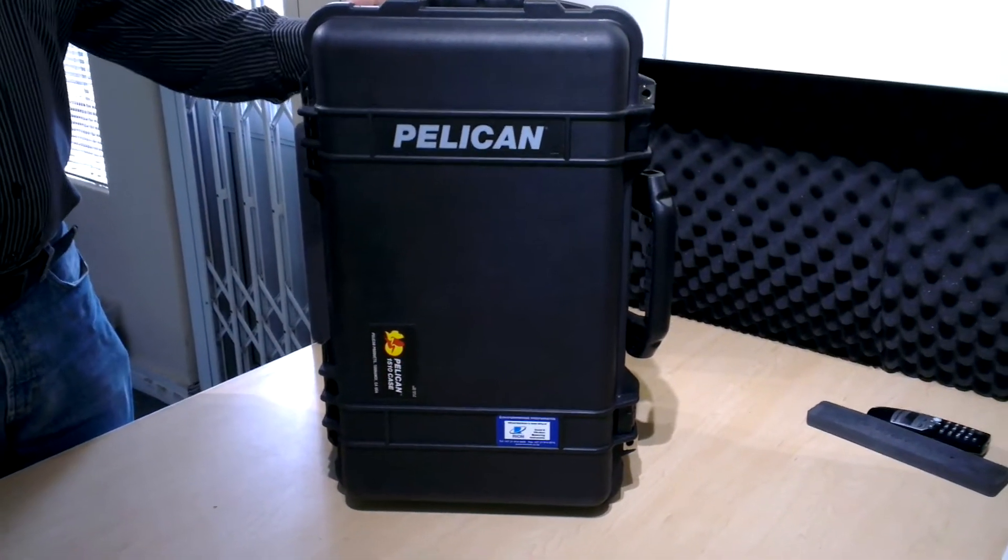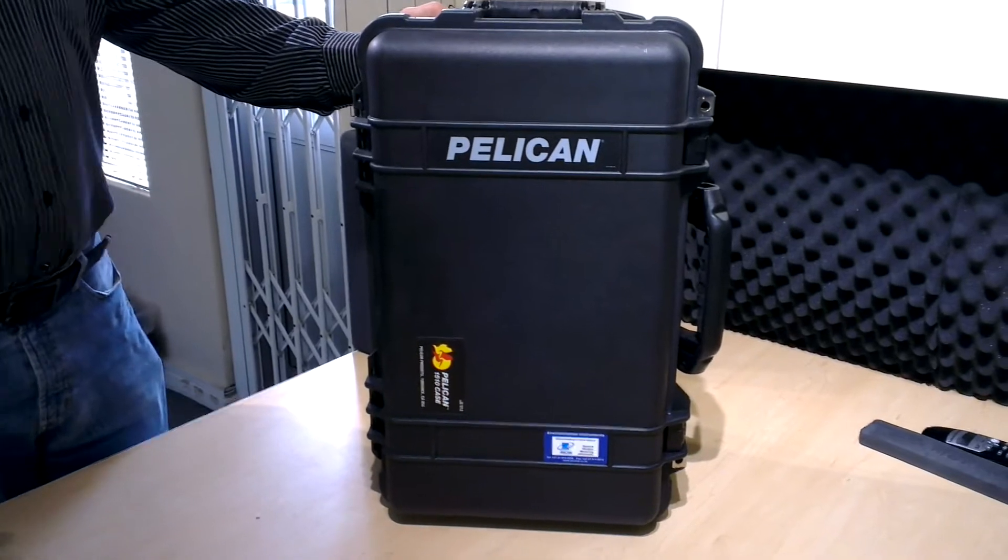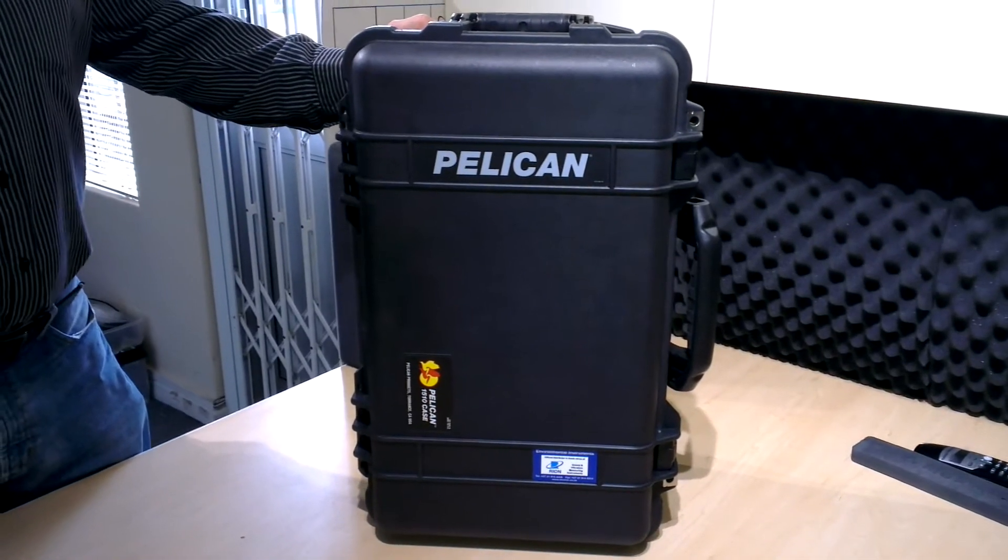This is an audiometer calibration system that was made for one of our clients in South Africa.